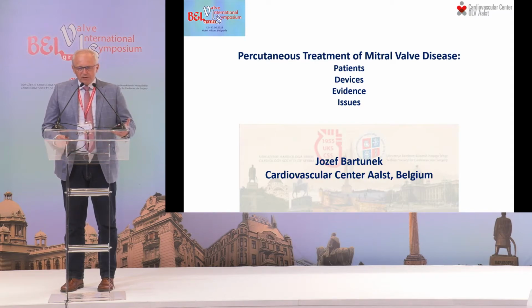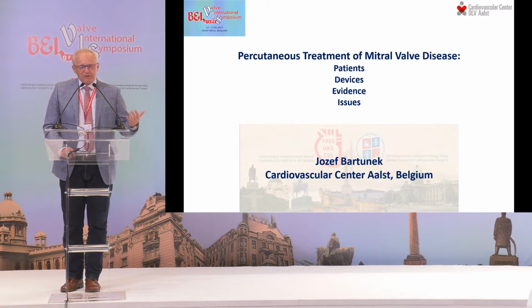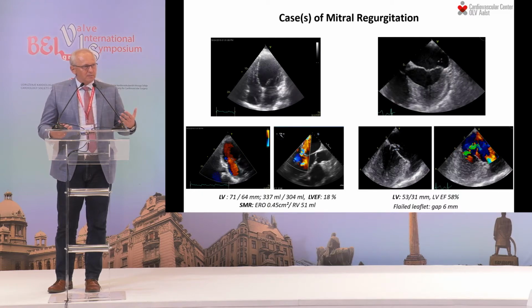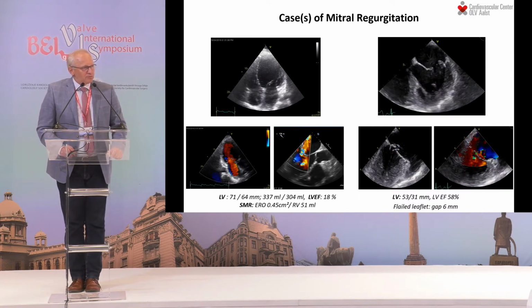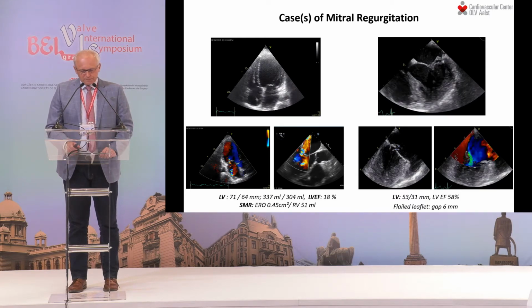So it's my pleasure to present you my opinion about the percutaneous treatment of mitral valve disease. It's a very broad topic, and I'd like to walk you through some issues about the patients, devices, evidence, and challenges. It's always good to see the real patients or cases behind what we are talking about. I will not talk about the Carpentier classification. I will just show these two examples of two main phenotypes of mitral insufficiency.